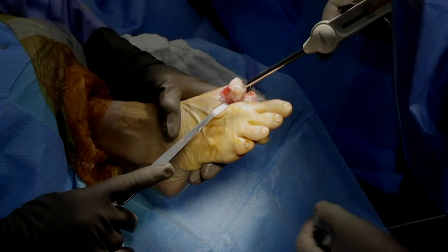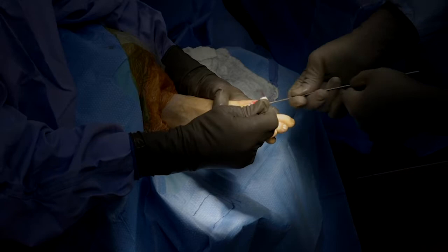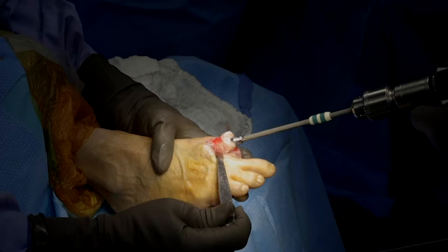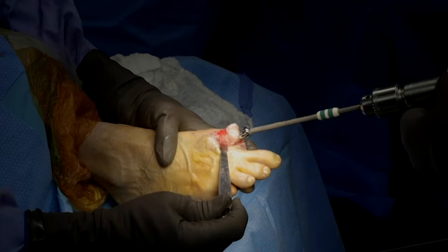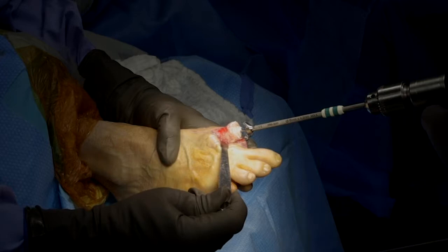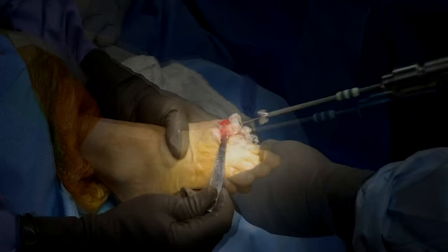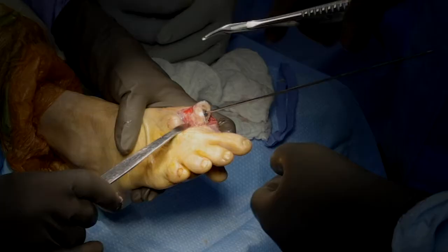When you start this reamer, you want to start it off the bone and have it going fast. This is a very aggressive reamer — the last thing you want to do is put it against the head and start the reamer because the teeth are sharp and you can rip the metatarsal head off. The tapered post has a stop so it will stop me from going any deeper. I put very gentle pressure to start, then once it's going I can put more pressure. The dorsal reamer has a tendency to not be as aggressive, so I'll take a rongeur and bite some of the dorsal spur off so it doesn't take nearly as long to ream that area.